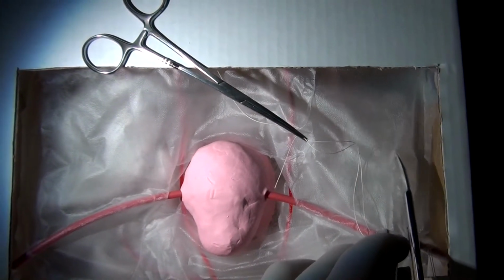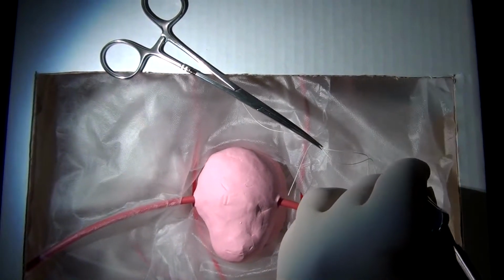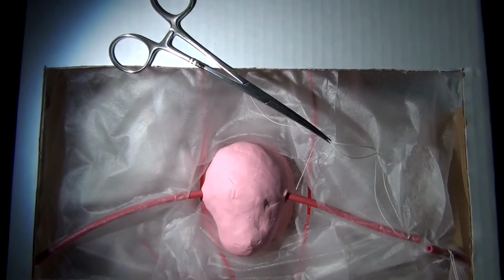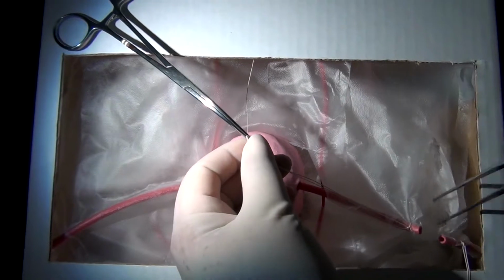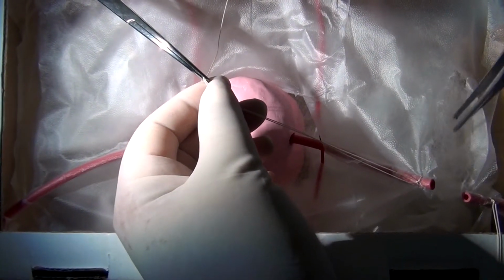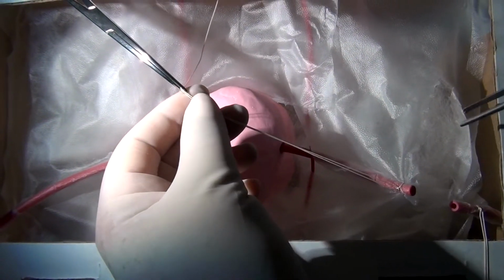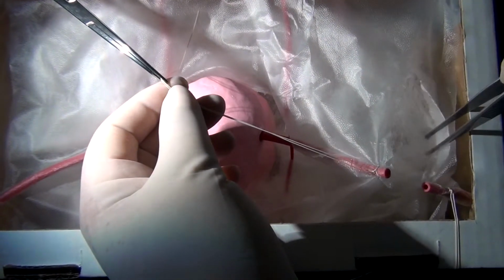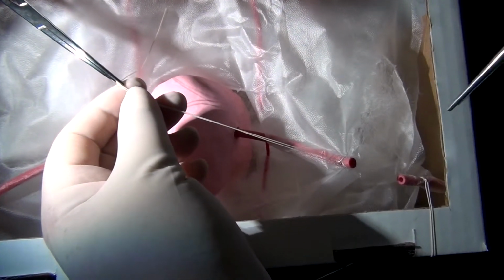So we're kind of lateral to the side wall. Open it up. And the goal here is to be able to find my ureter as well as the infundibulopelvic ligament. So this is the lateral surface actually of the posterior sheath of the broad ligament. This is typically areolar tissue that you'll find when you open up this space. This is the triangle that's always talked about, the lateral surface of the pelvic wall, the medial surface of the posterior sheath of the broad ligament.